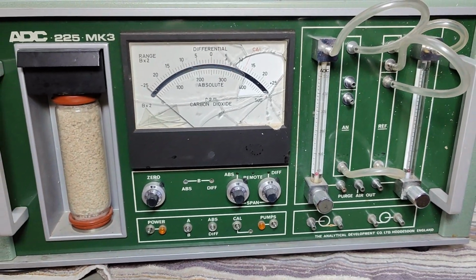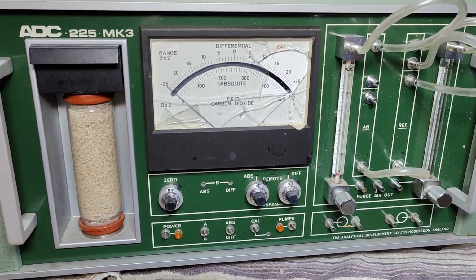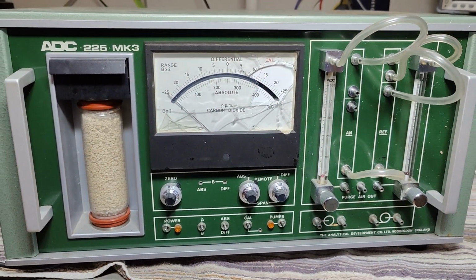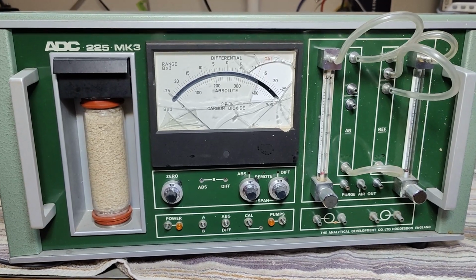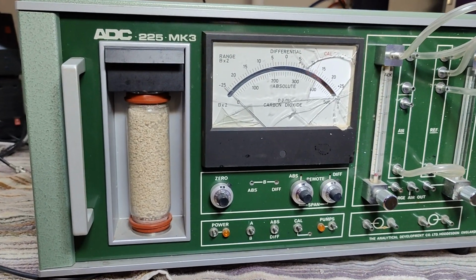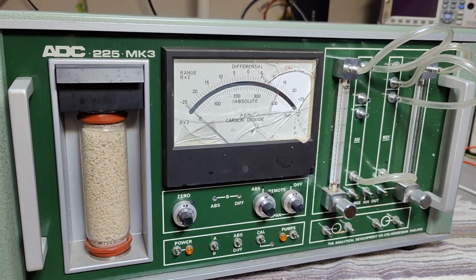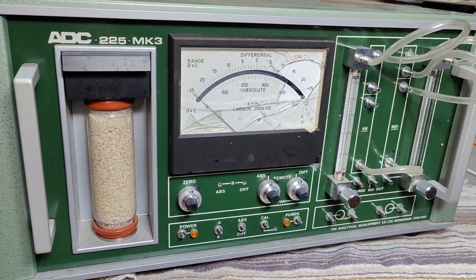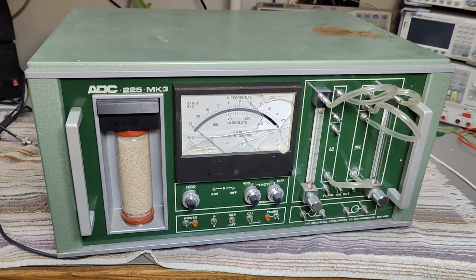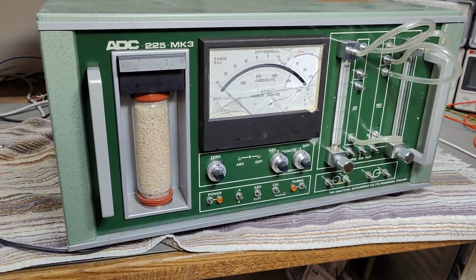But the thing is, this one was, of course, violently thrown out because it's not working. And I don't have any kind of use for this, and I don't have any kind of equipment to test it. So what we're going to do is just pull it apart in this video and see what it contains and how it is designed and such. I can tell you this thing is 27 kilos. So it is huge and very, very heavy.